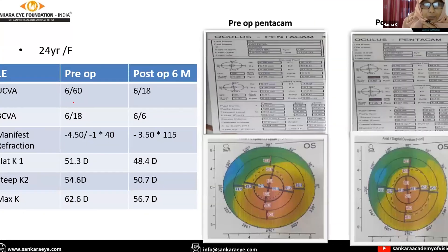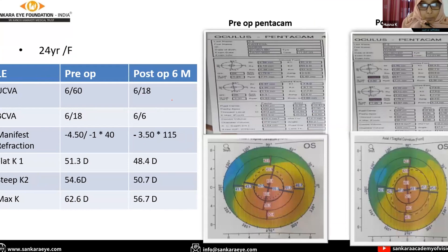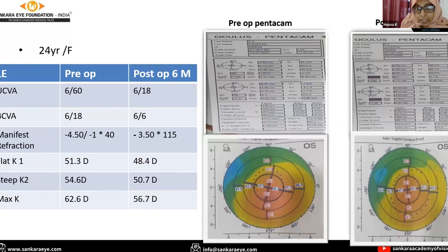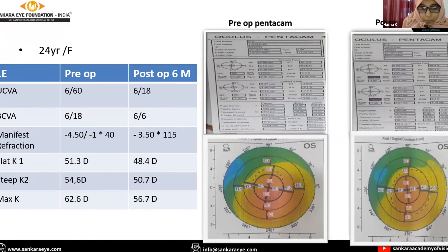This is a case of left Intacs surgery done in our hospital. We can see the improvement of visual acuity and manifest refraction postoperatively. This is the pre-op pentacam and this is the post-op pentacam, showing improvement of corneal curvature. Steep K2 was 54.6 diopters pre-op and reduced to 50.7 diopters postoperatively.